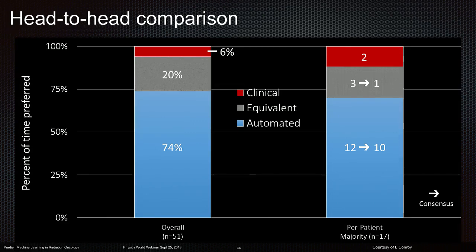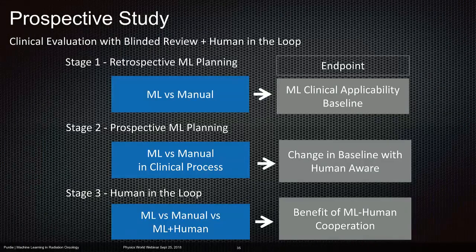What we're driving at is that through the idea of using these atlases and the dose mimicking, we're able to extract the best features from a number of patients, not just one patient. We think this is a strength of the methodology: leveraging some of the best parts of the distribution from a sample of patients and using that when we're doing our prediction, which is helping here. So that was that study.